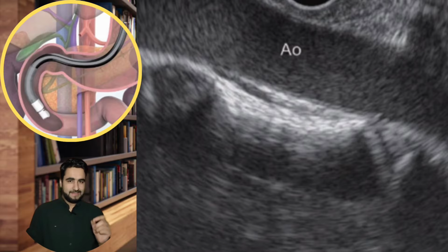Today is lesson number 4 on approach in endoscopic ultrasound. Today I will be discussing D2 station, that is descending part of duodenum, in detail. In the descending part of duodenum, always start imaging in a short axis position, that is, in which the scope is stretched. Let's analyze here.